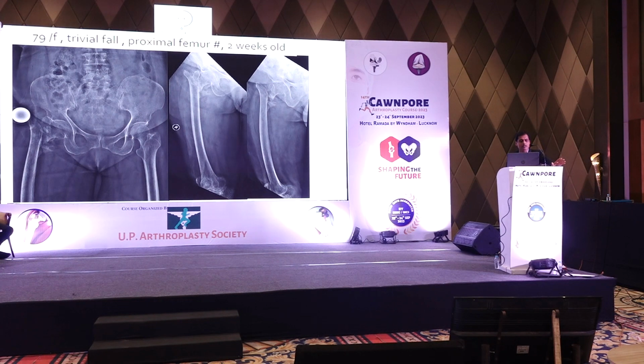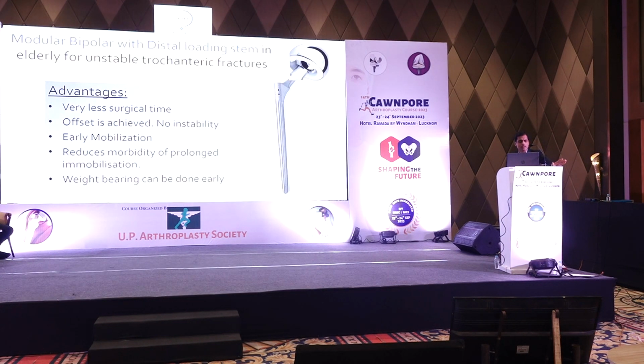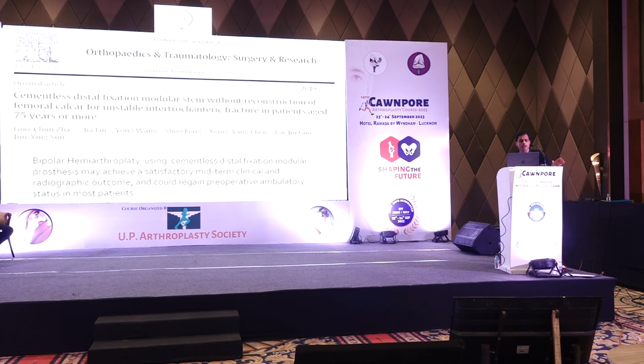Again, one more example. Look at the fracture, very osteoporotic in the trochanteric region, unstable, almost a 4-part fracture. So again, a distal loading stem with a modular bipolar. Even in the literature, the advantages are less surgical time, offset is achieved, early mobilization, reduced morbidity and mortality, and we don't need to immobilize the patient for a long time. The literature also reports that these stems serve very well, particularly in acute trochanteric fractures. A modular bipolar with an uncemented distal loading stem gives excellent results, particularly in elderly patients.